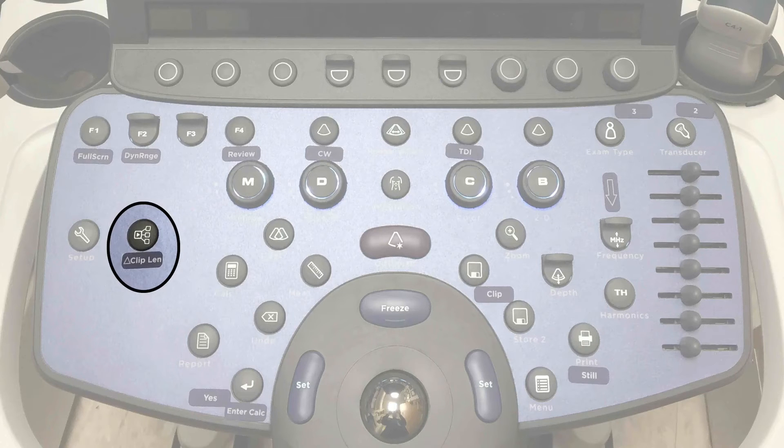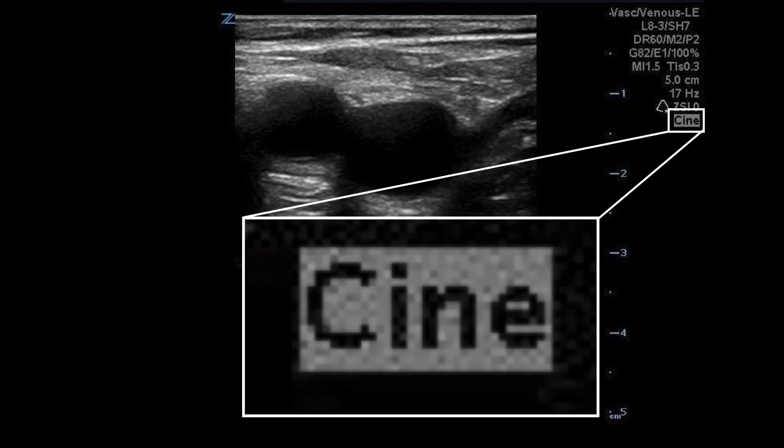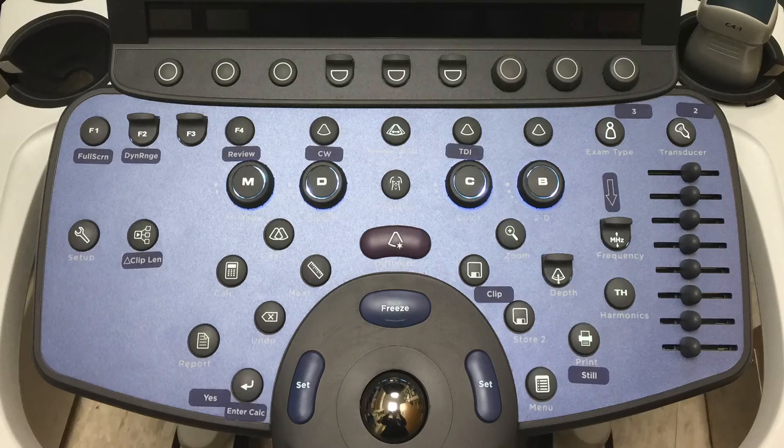Unlike the Sonosite systems, the clip length will only be changed while you are scanning on that patient. To capture a still image, freeze the image on the screen and then press the store key. You will then capture a still image. Once you freeze your image, you'll see the cine mark, which tells you there's a cine loop available.